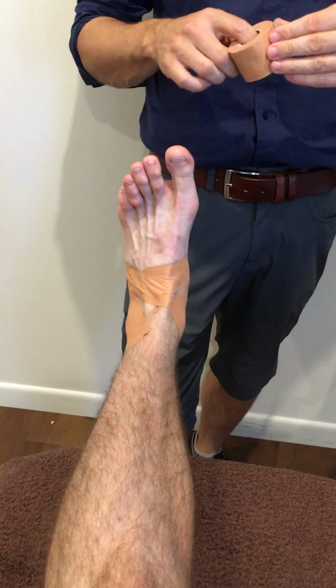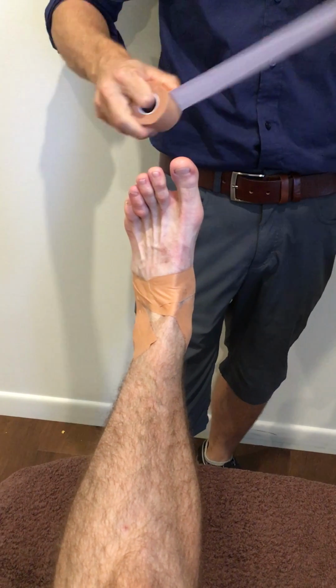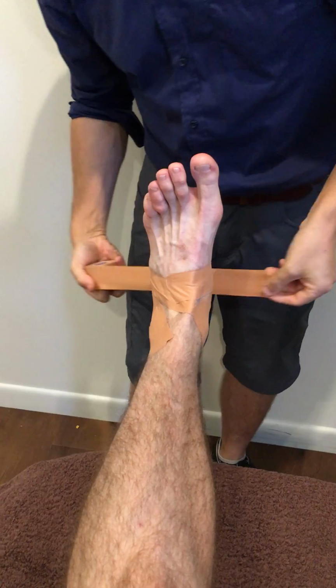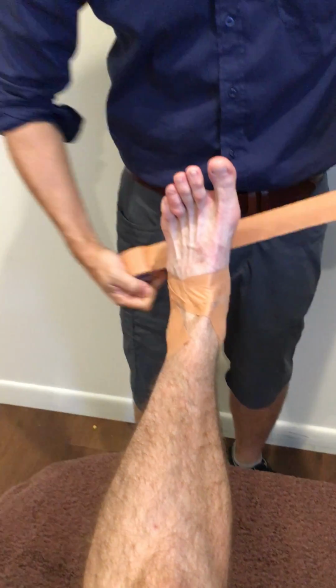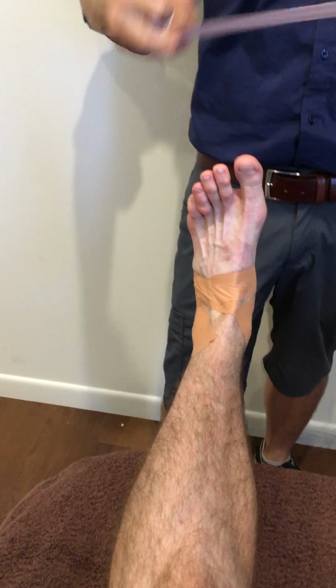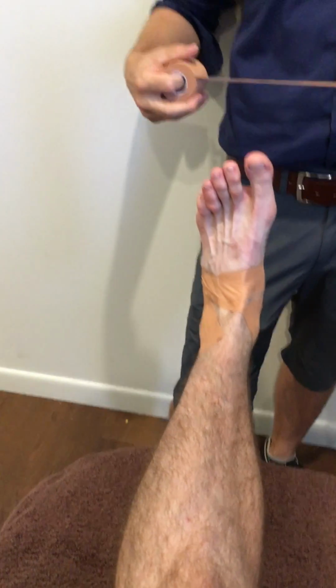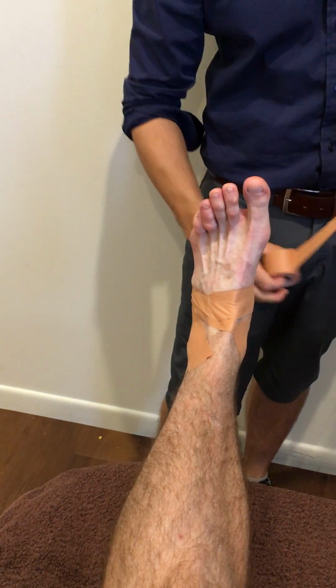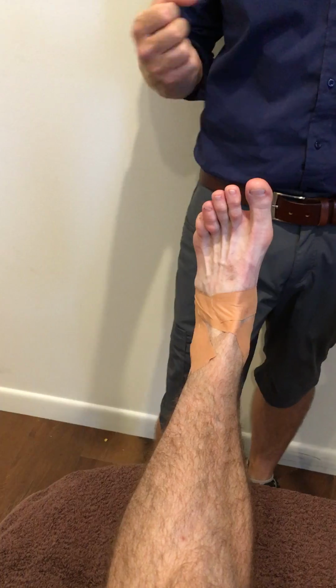I often, as you can see, will take a strip out and then tear it off. Unless, like that one, I was trying to get a little bit more pressure across, so I held onto it to pull on it. Otherwise, I take it off so you don't get too much of a tourniquet, because you can get too much pressure, especially when we're doing lots of walking. They do loosen up quite quickly, but you don't want it too tight.